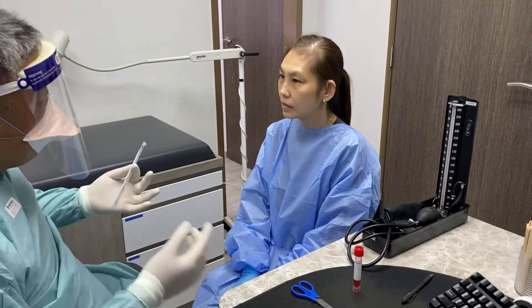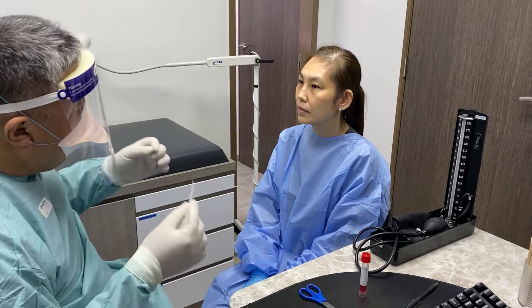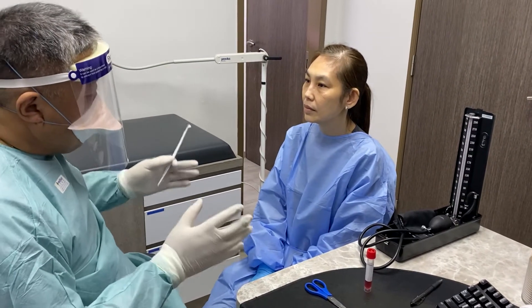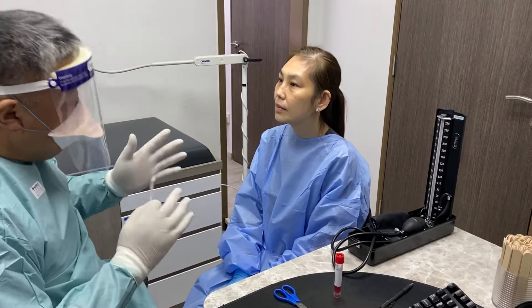Good evening, I'm Dr. Thanh. I'm going to do the swab for you. This is a PCR swab, basically to see whether there's any COVID virus at the back of your throat and your nose. This procedure is very simple. It will be done in one to two minutes.